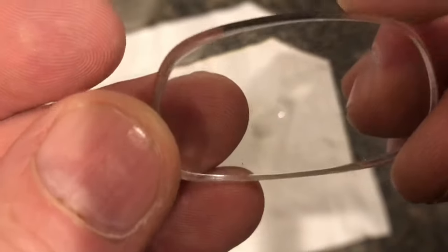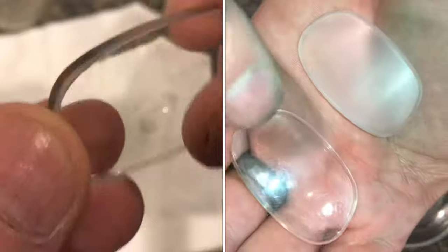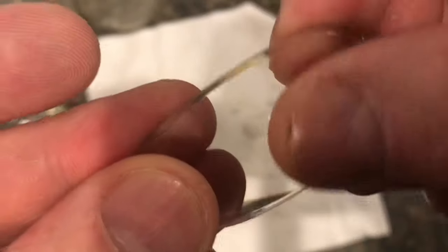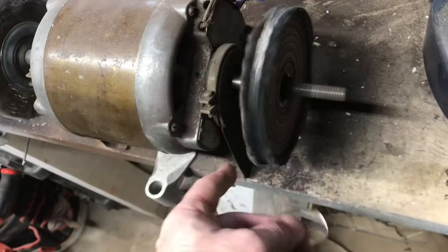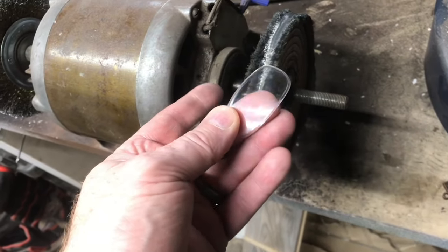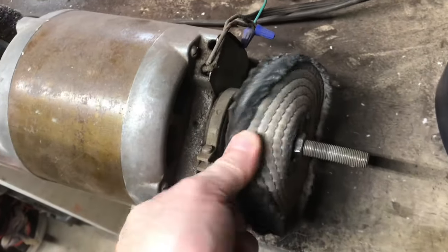It is possible to get these small scratches out, but what's going to happen is you're going to end up hazing the lens, and then you'll have to make sure you have the equipment to bring it back to a full shine. Without a high-speed polishing wheel, sometimes it's hard to get that luster back. This is a cotton buffing wheel that you can pick up at Harbor Freight for about five or six dollars.